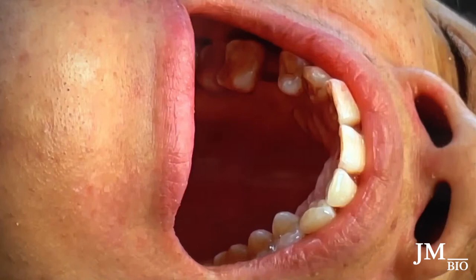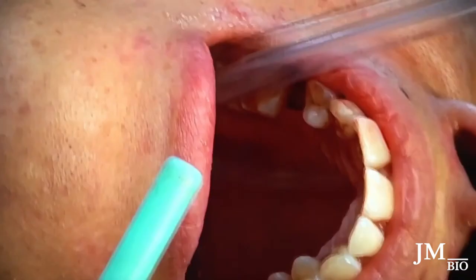I haven't laid a vertical releasing flap — it's just an envelope, like a little mini-flap. The reason I laid this flap was, number one, to show a video for you guys, and number two, just to clean the tartar off the tooth.